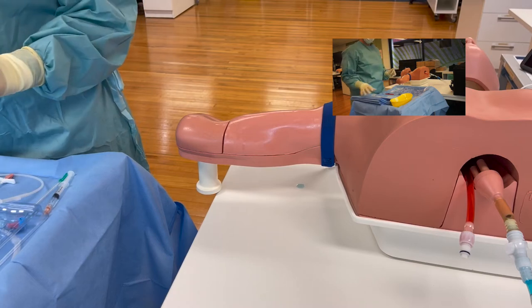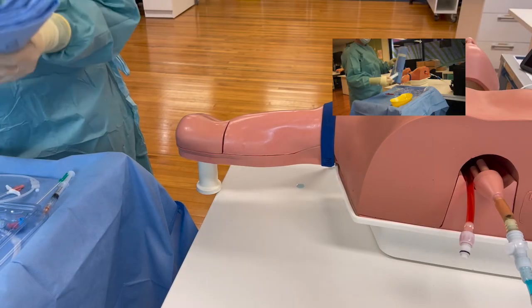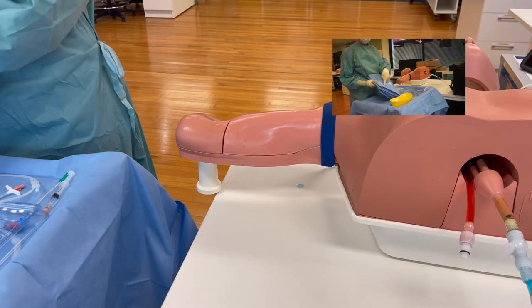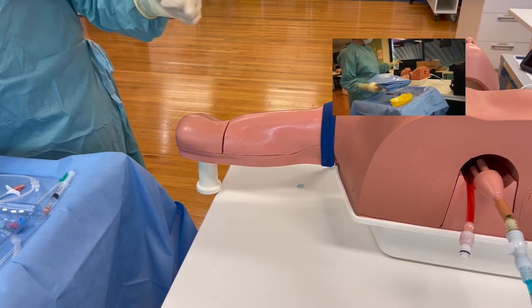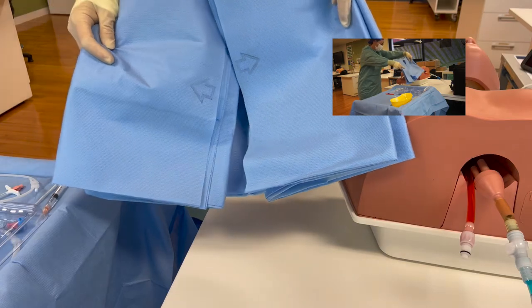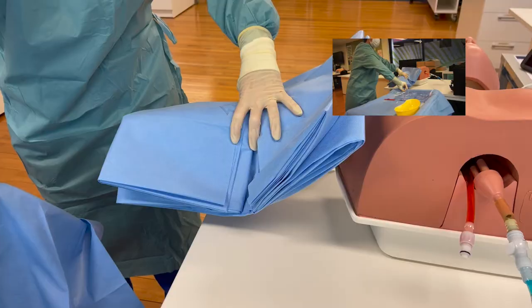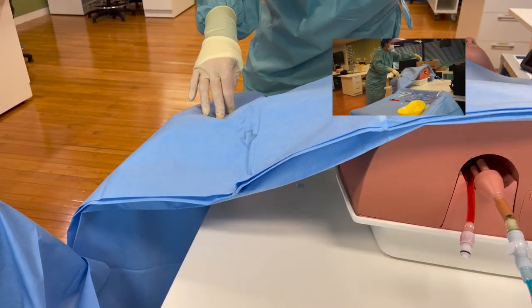When the chlorhexidine alcohol is dry, you're going to remove the peel tabs on your fenestrated drape and discard those. Observe where the head image is and align the drape with the head. When you place the drape down, you want to make sure the adhesive is on the clean side of the tourniquet - the part of the arm that has been cleaned. It may help to come to the side of the patient. Make sure to wrap the sticky bits around the arm, cover down the arm, cover across the patient, taking care not to touch the patient.